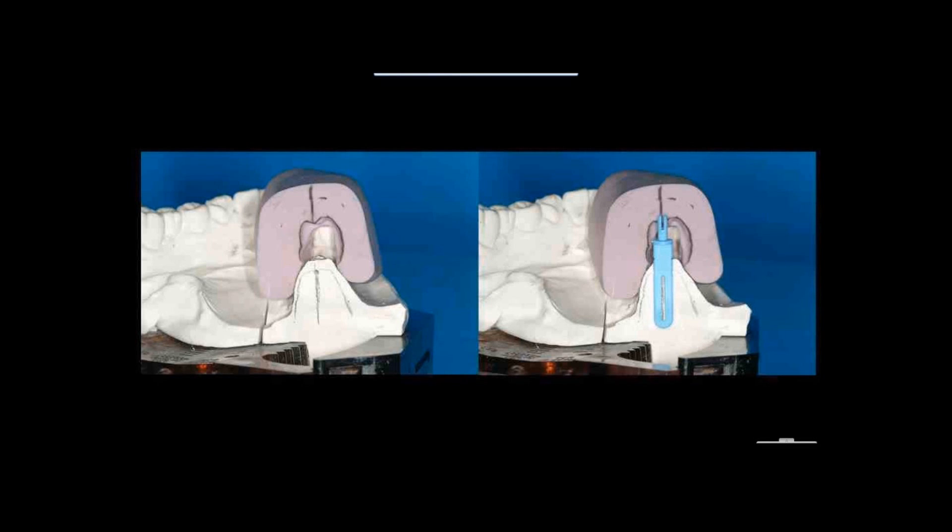Essentially the cross-sectional view shows the crown shape and where I would like the screw access hole to be — in the central fossa in this case. You can see a hole where I want the top of the implant to be. On the other side, I've placed the buccal-lingual positioner, and so now I'm locking in all these parameters.